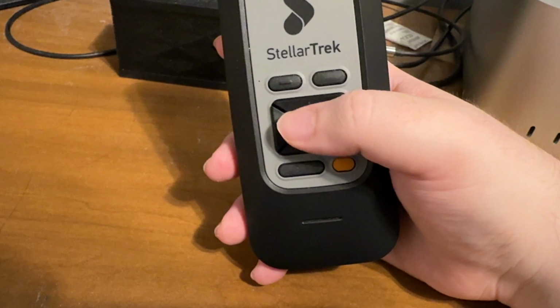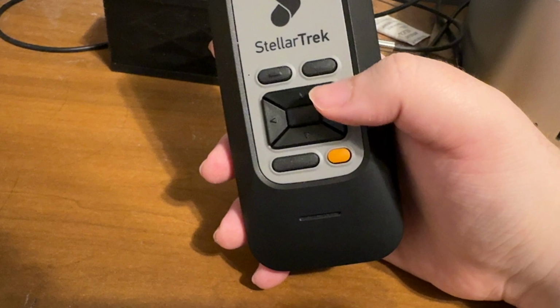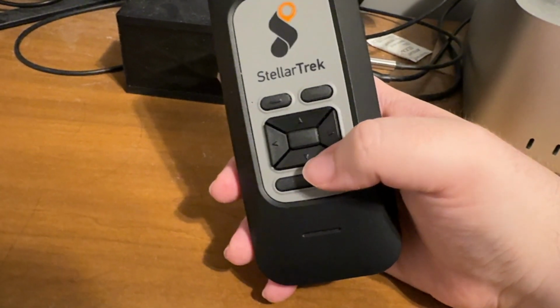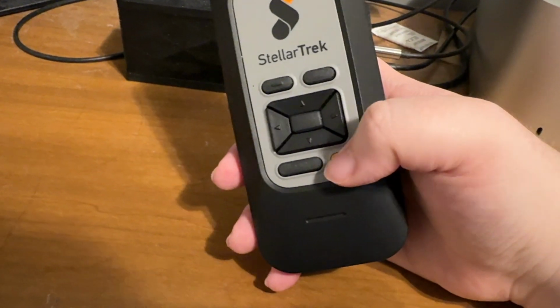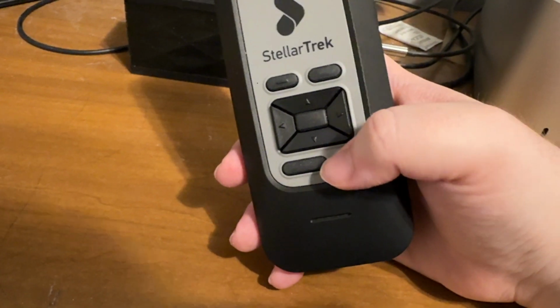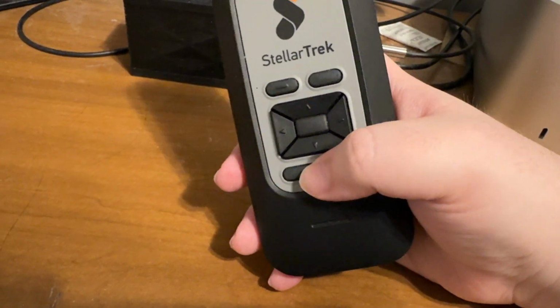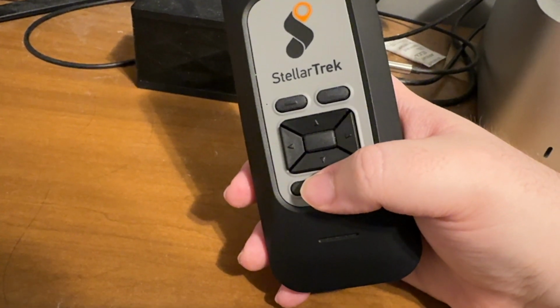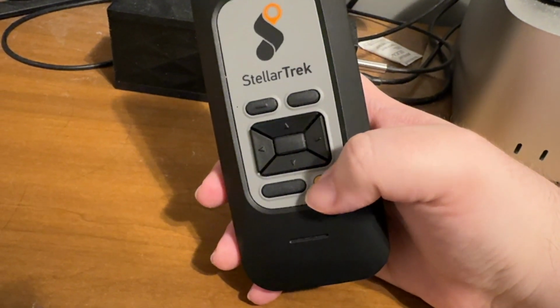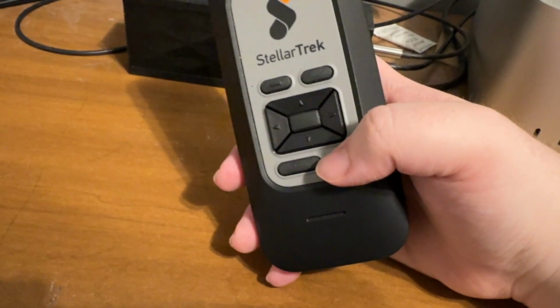So another way you can also enter text with the StellarTrek is by using a Bluetooth keyboard. I didn't demonstrate it here, but I know that is a function that you can do. Now, I also do appreciate that there is a voice option, and I do find for me that that is my preferred way to enter in address details. Now, I'd also like to see that work for renaming a landmark by text as well. I think it's just a nice way to enter really anything, so I think having it there could be helpful.